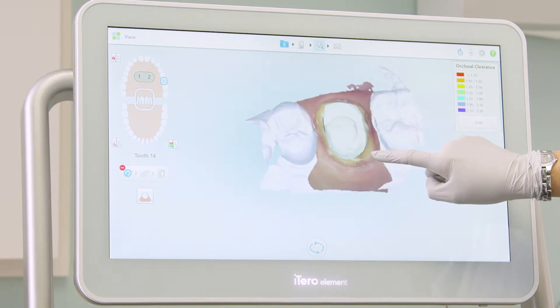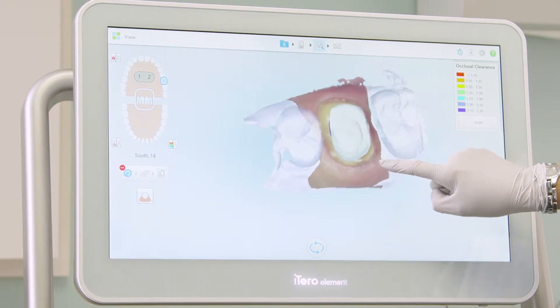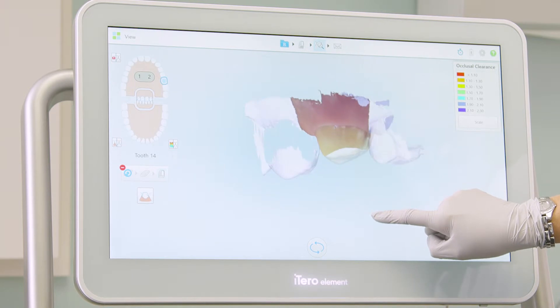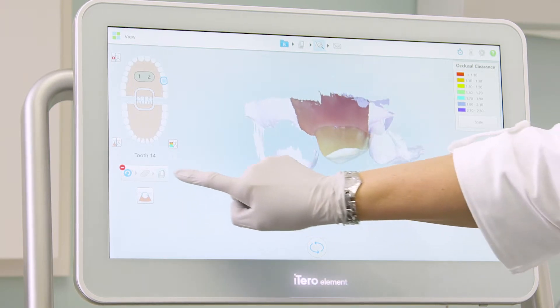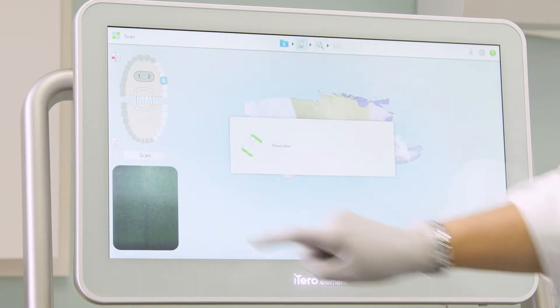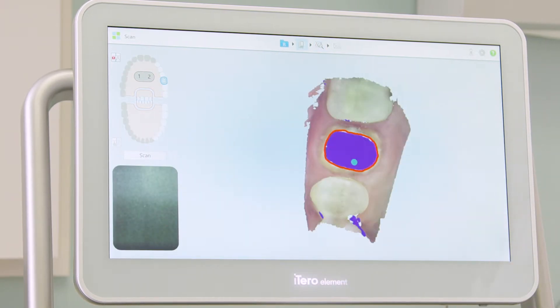Rotate the model to ensure that I have erased the appropriate anatomy. Rescan the area to fill the area I have erased.